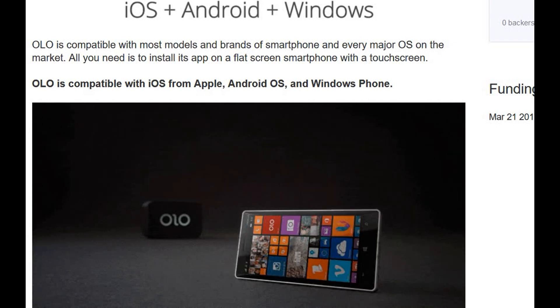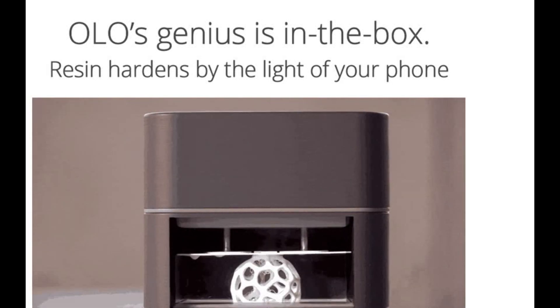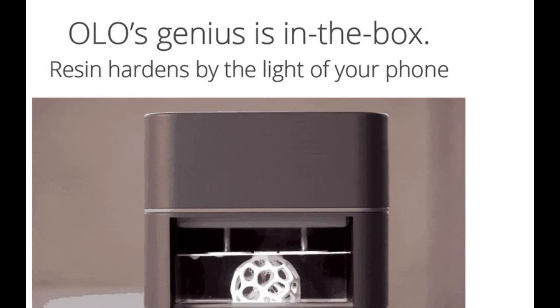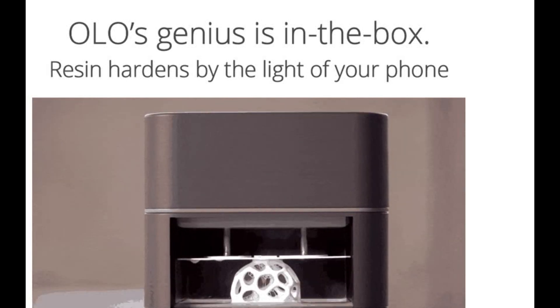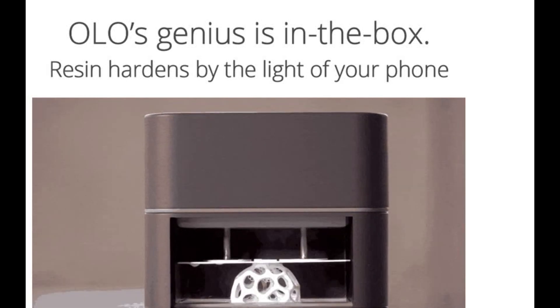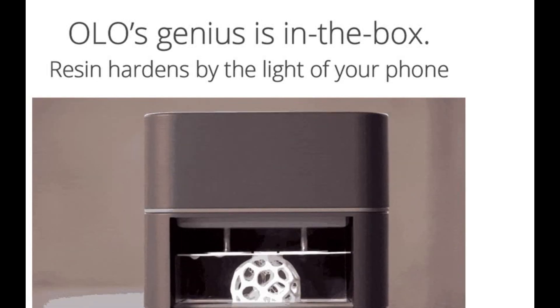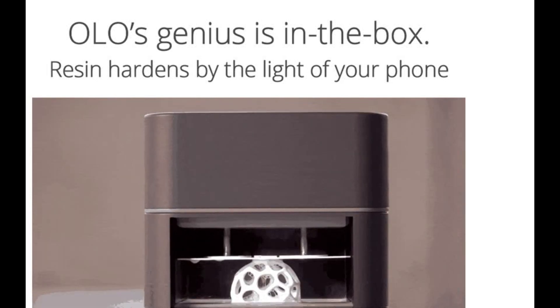With conventional 3D printers we need special UV light to harden the resin, but with this printer it uses special quality resin that is hardened by the light of the phone itself. That is another important feature of this printer.